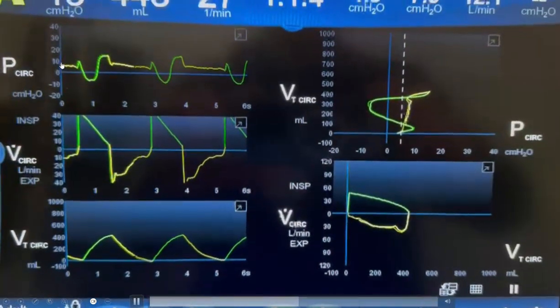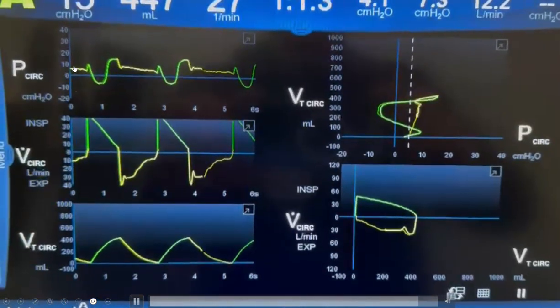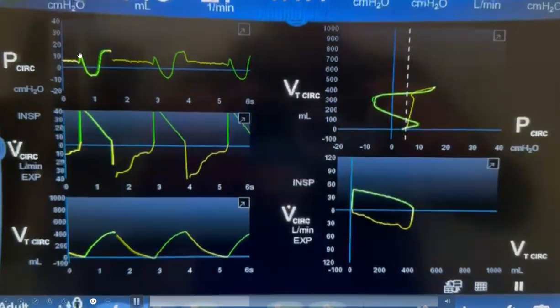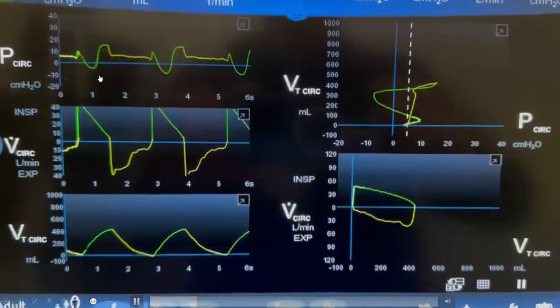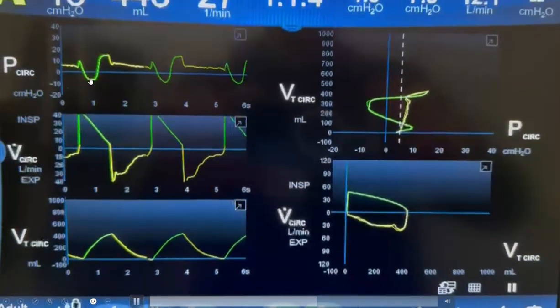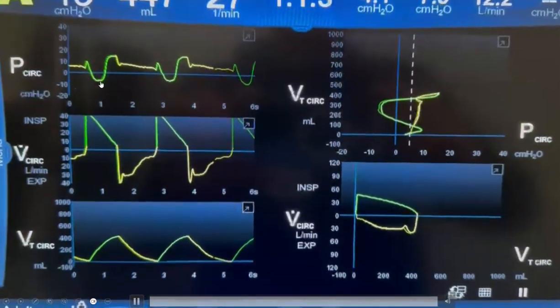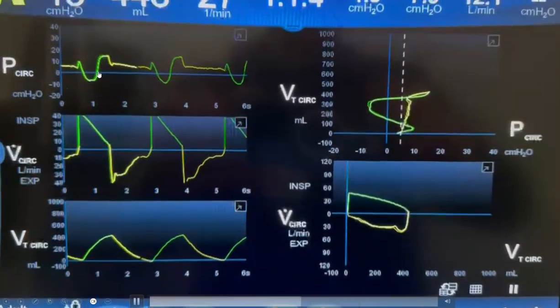The PEEP level is at 8 centimeters of water, and then after that what you see is a drop in the inspiratory pressure. It goes down all the way to minus 7 or minus 8 centimeters of water.